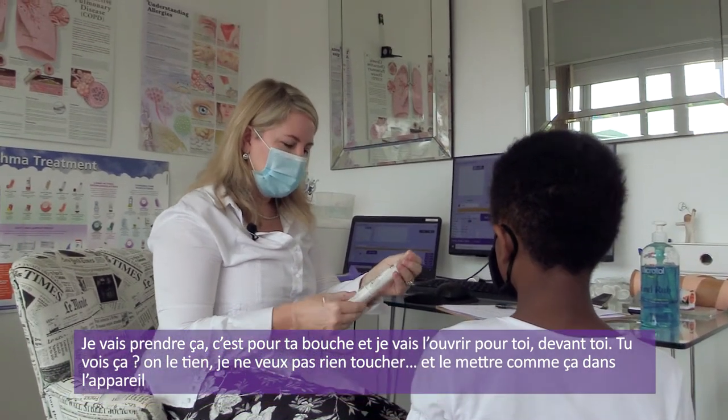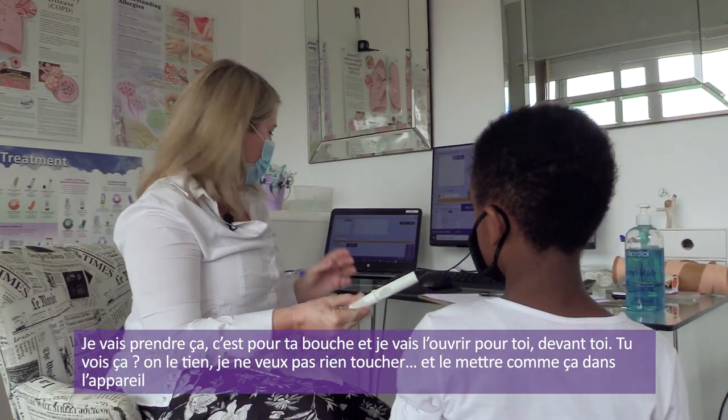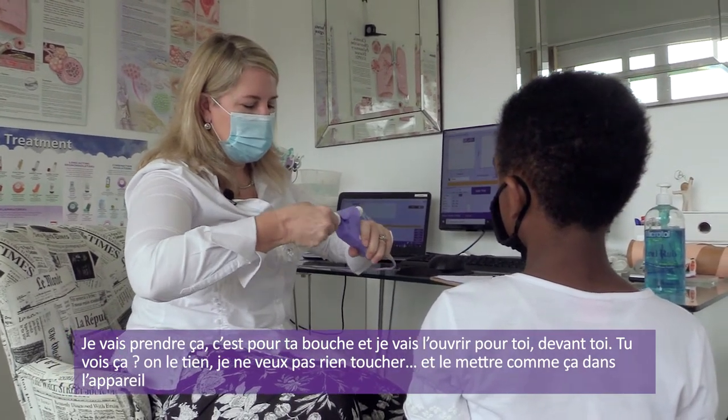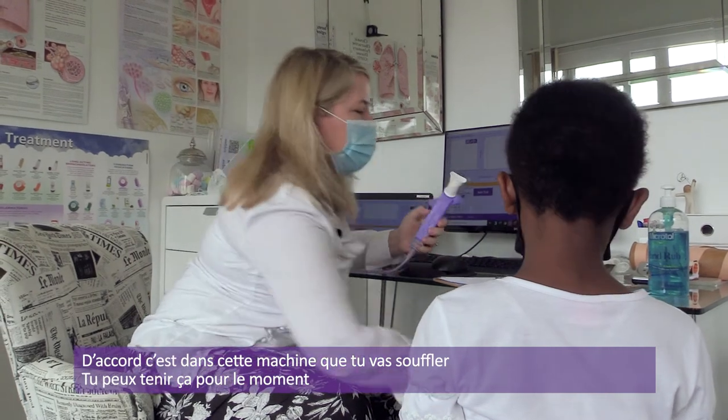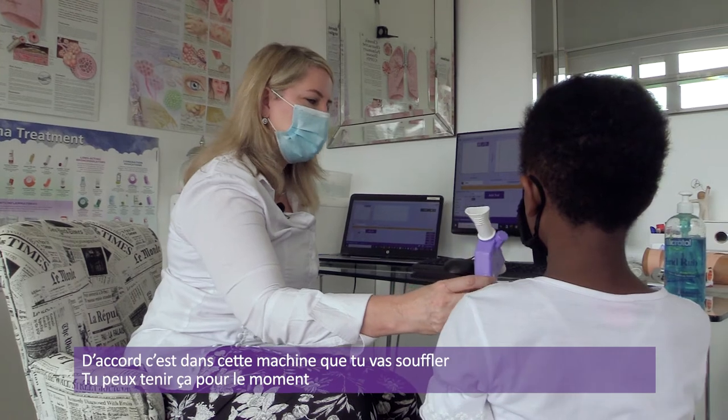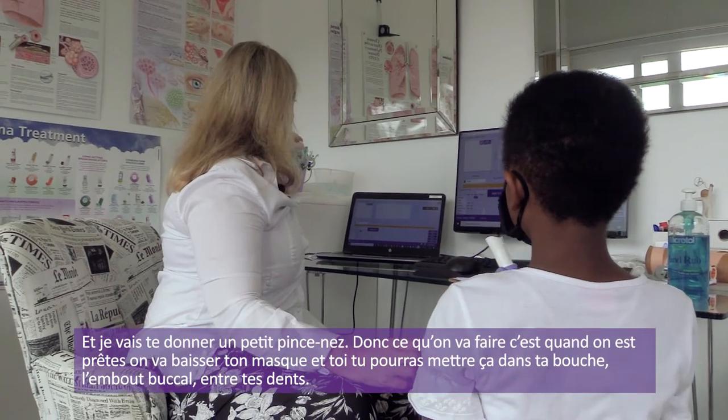You can see that. Okay, you hold it so that you can't touch anything. Put it into the device like that. All right, and this is going to be the machine that you're going to blow into. So you can just hold that for the time being. And then I'm going to give you a little nose clip.